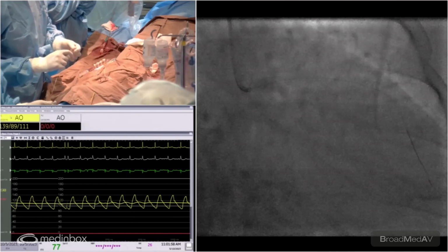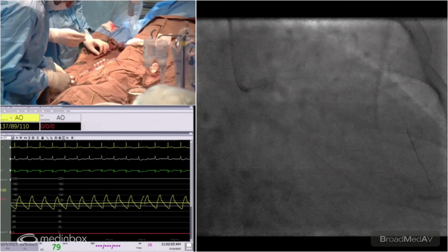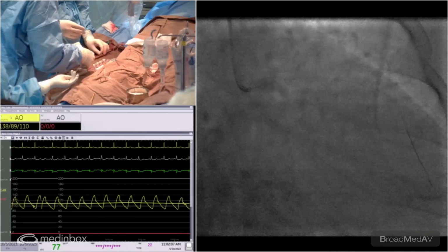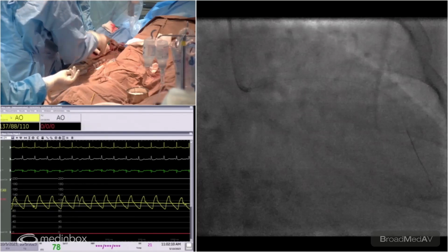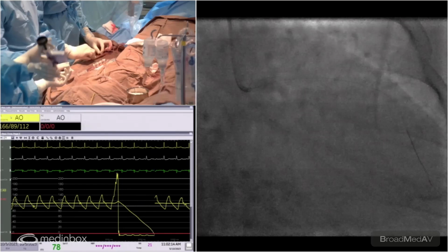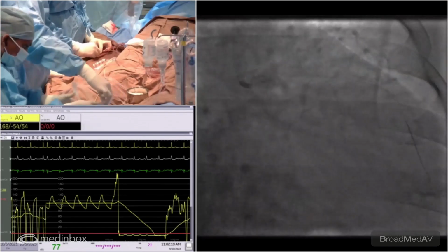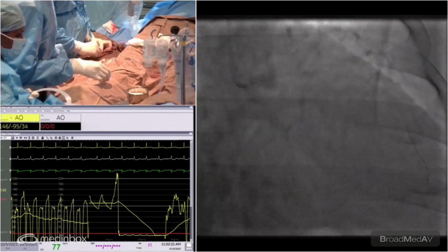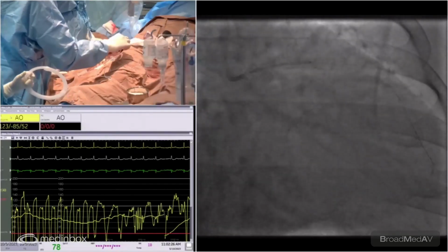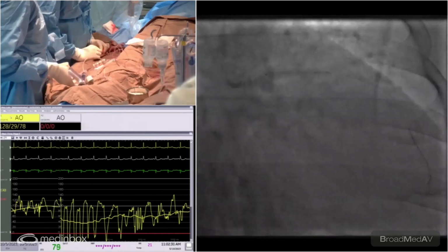We can also use the OCT to make that decision. So you can make some measurements and please give it to them, please, from the OCT. Yeah. So that's just at the diagonal. So the OCT tells you very clearly that we should be deploying the stent just before the diagonal. So we're going to use a 3/28. Place the distal end of the stent just before the diagonal, and the rest will overlap into the other stent. Yeah. Let's go AP cranial.